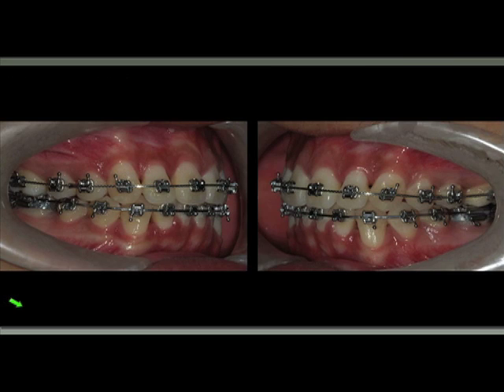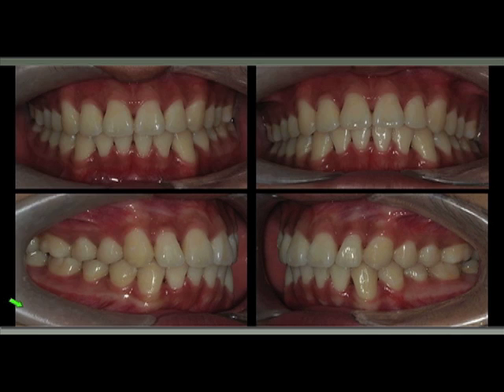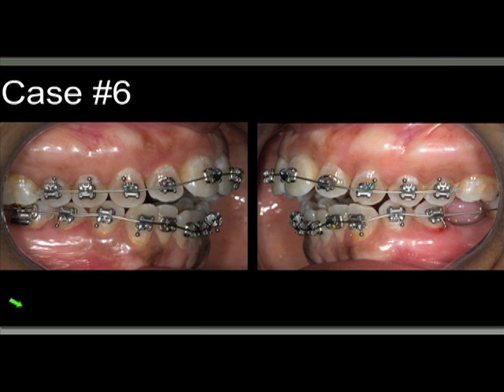So that's the first wire. This is the last wire before removing the appliances. And you can see right over here is the final result, achieving the same goals as all the other cases. Or you can see this case number 6, the last one, just a few examples.